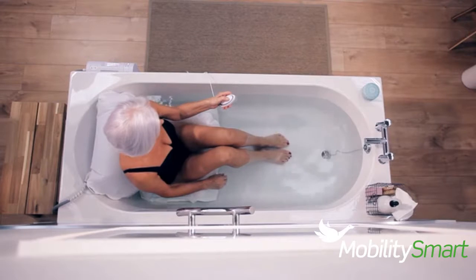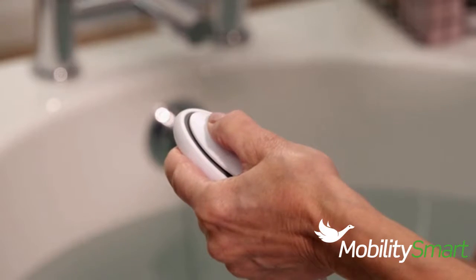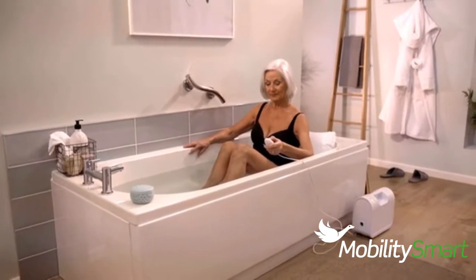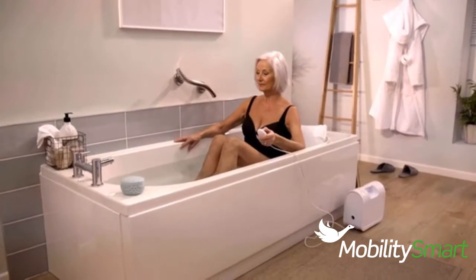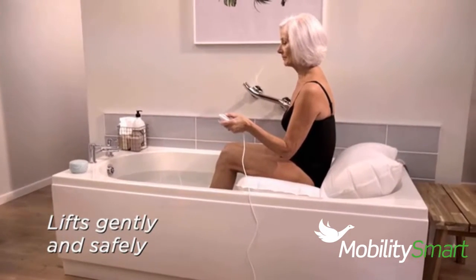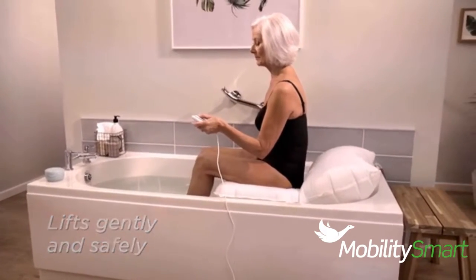When you're ready, sit up and position yourself at the back of the seat. Using the waterproof handset, reinflate the bath lift to raise yourself out of the bath. The bath lift moves gently and safely, making getting out of the bath almost as relaxing as having one.